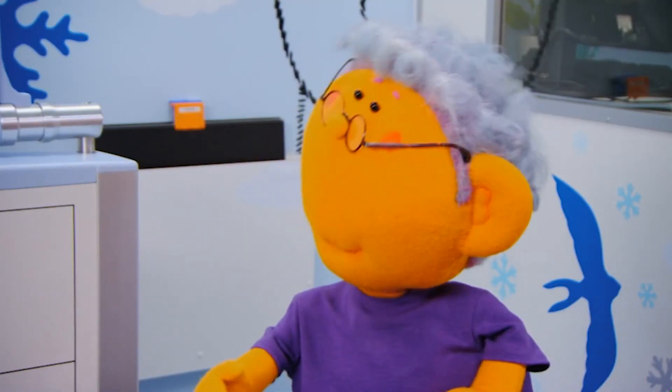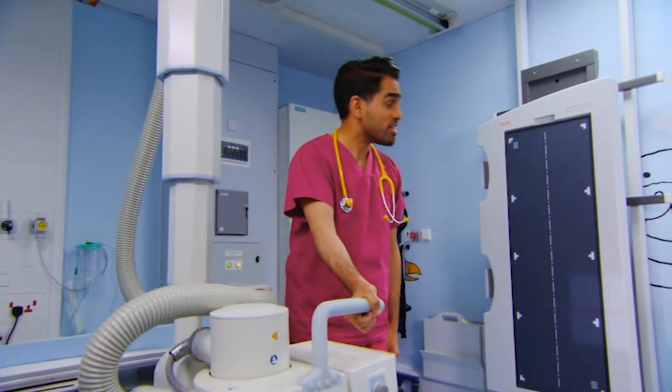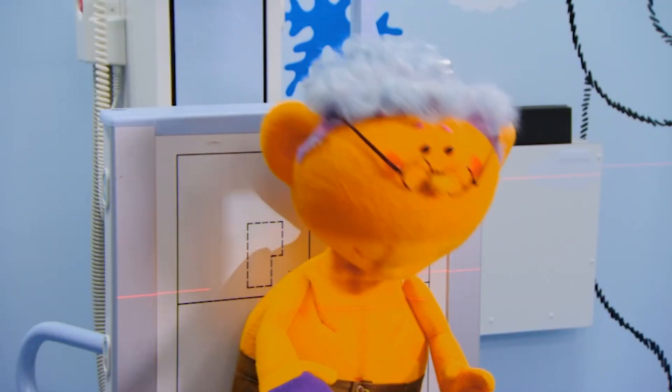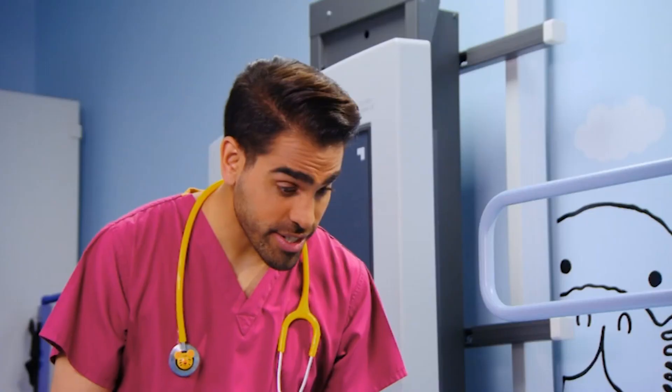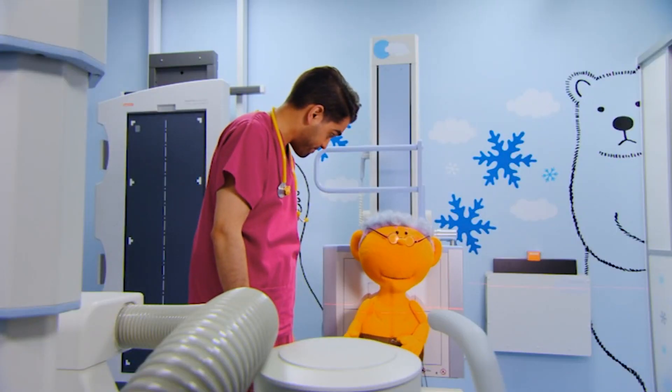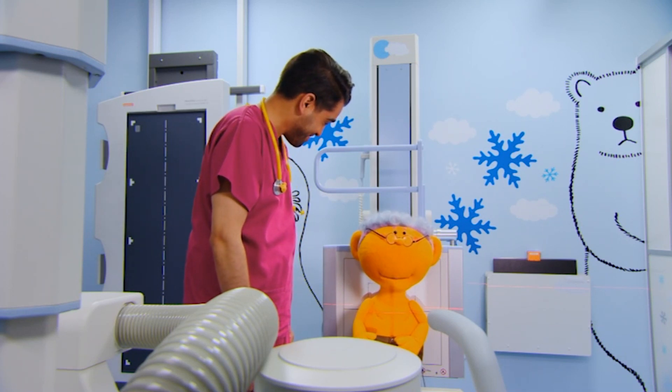OK. Now I'm just going to line up the X-ray in the correct place to get the best picture possible of your lungs. All you need to do is stand very still while I check it's lined up and ready. I'm keeping very still, Dr. Ranj. Great. So if you're comfortable, I'm going to go behind that screen.